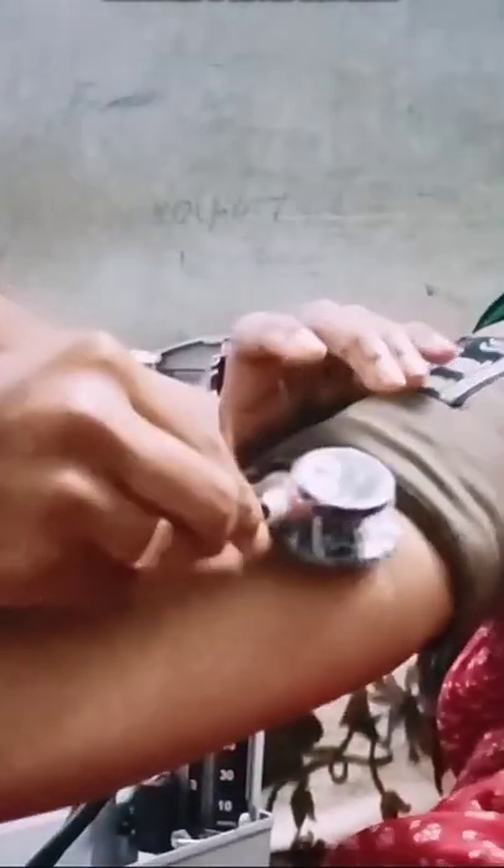Begin blood pressure measurement. Use a properly sized blood pressure cuff and wrap it around the upper arm. Lightly press the stethoscope bell over the brachial artery, just below the cuff edge.